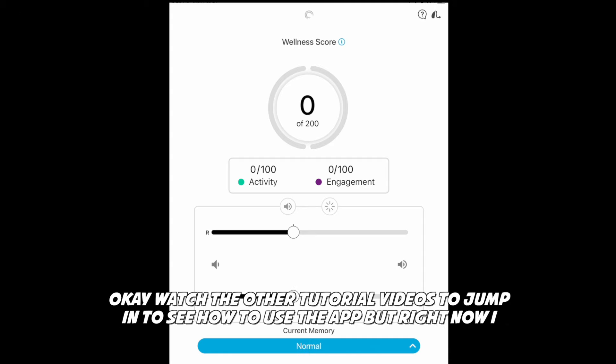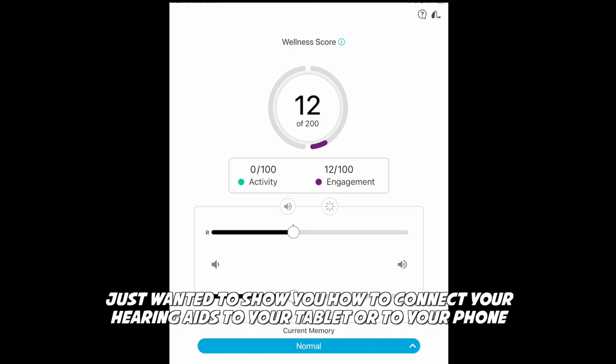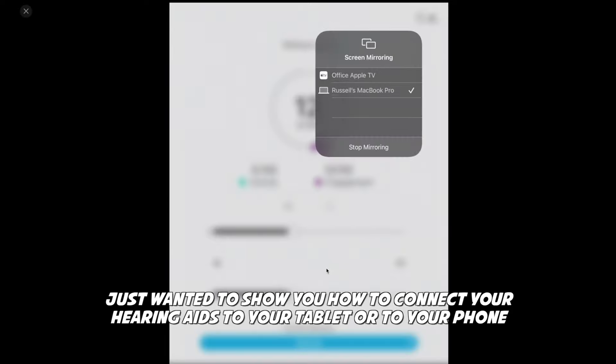Watch the other tutorial videos to see how to use the app. Right now I just wanted to show you how to connect your hearing aids to your tablet or to your phone.